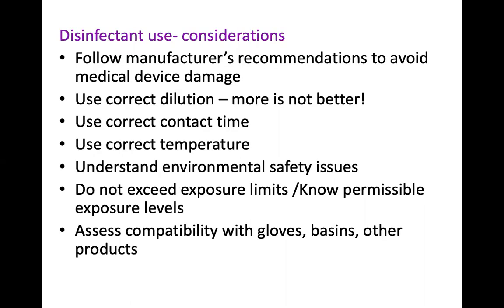For disinfection, I'll just talk about it in brief. Disinfectants that are available are chemicals, okay? And for these disinfectants, you really need to be guided by the manufacturer's recommendations. It is compatible with which kind of material? That is one. Two, what is the optimal dilution percentage, concentration? More is not always better, as I had mentioned. You also need to understand environmental safety issues.